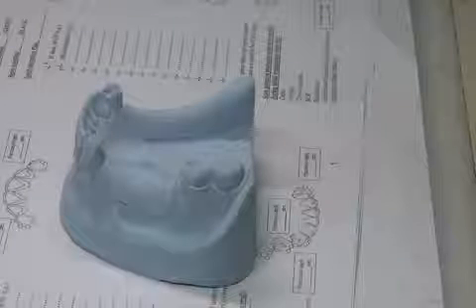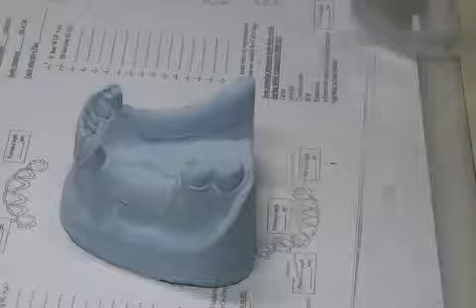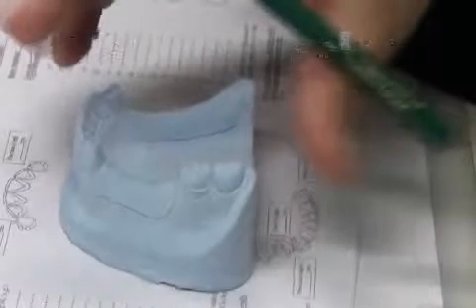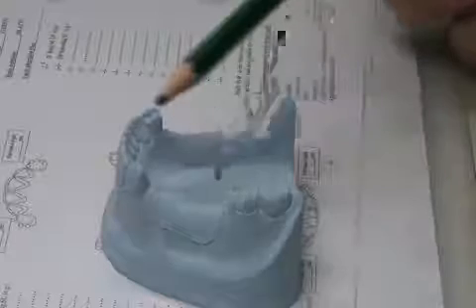Okay. What did we put in the bounded saddle area? Open lattice ولا mesh? Mesh. In our purpose in the case we gave you, we changed it to a mesh just for learning purposes, not based on occlusal analysis inside the patient's mouth. For educational purposes, we made you deal with an open lattice to see it, and really feel it, and look at it, and really understand how thick it is. On the other side, you use the mesh, and now you know what a mesh actually is. So we changed this design here just for educational purposes.